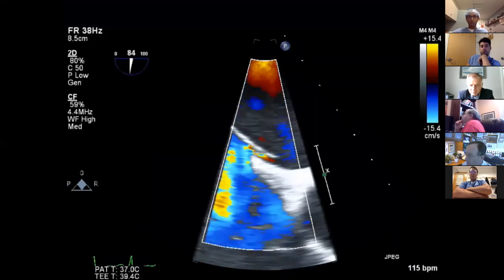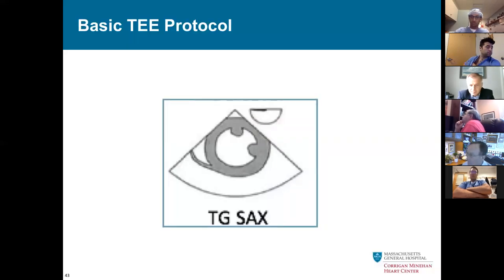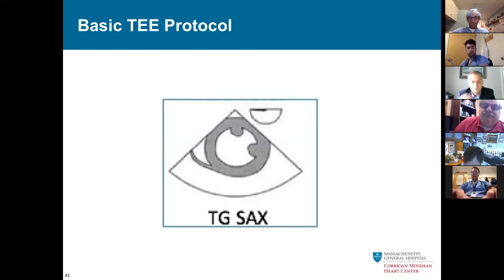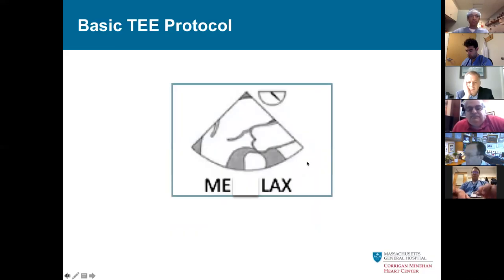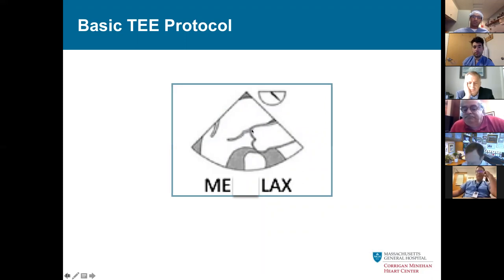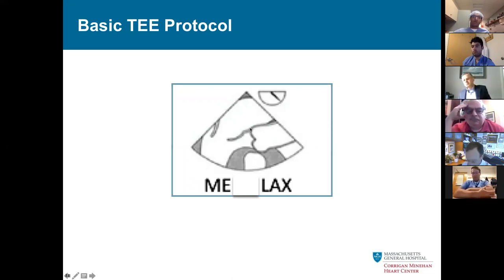The mid-esophageal long axis view lets you see the mitral and aortic valve together. Looking at the aortomitral curtain, you can see if it's thickened or has pathology. After a very long case it will almost always appear edematous, so you want to look pre-op — those are the cases where you can identify endocarditis at the curtain.